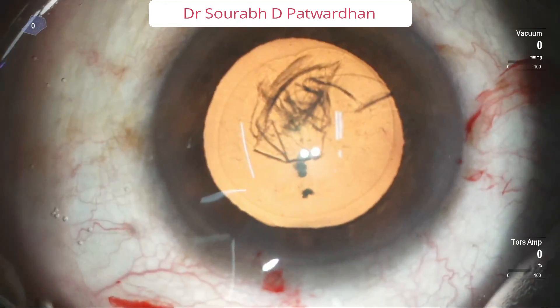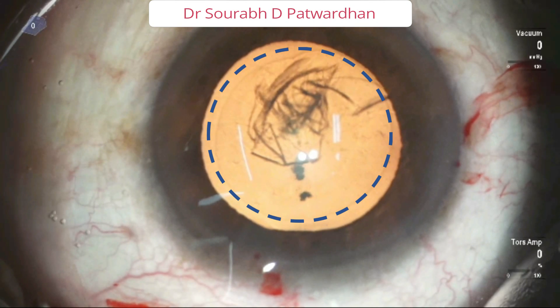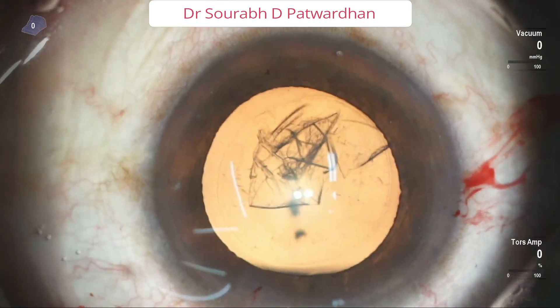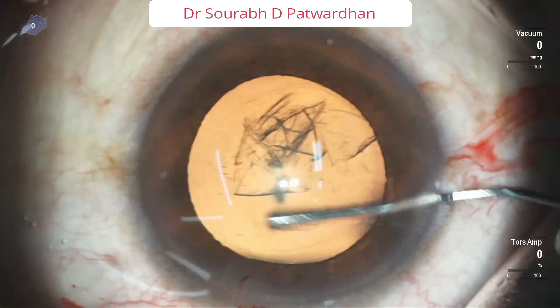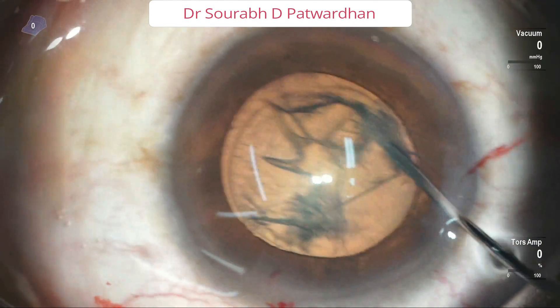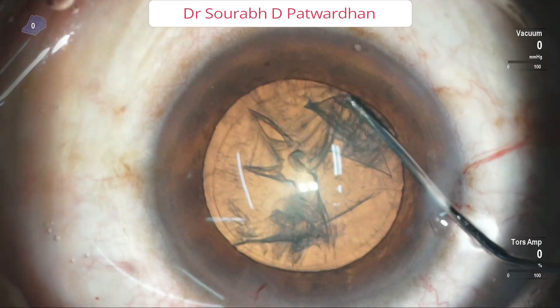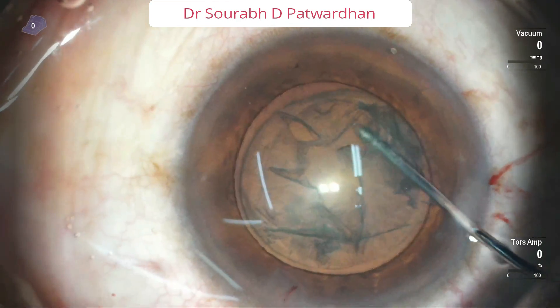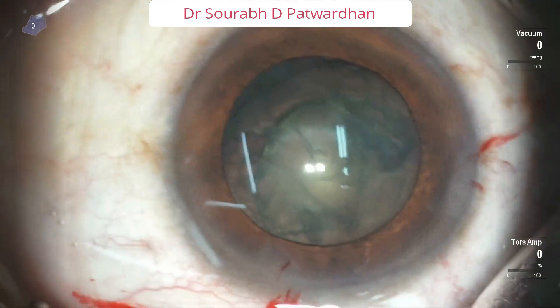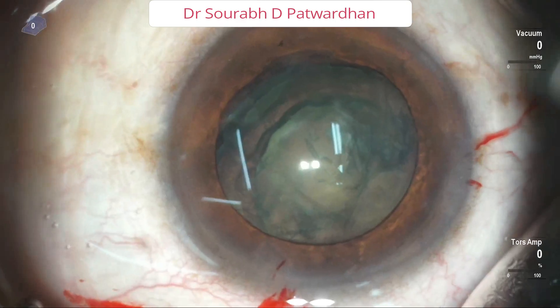This is the ideal CCC. Once you get the CCC right, the next important technique is to do a good hydrodissection. It is important to do a cortex cleaving hydrodissection like this. The fluid wave should be nicely visible. I push the fluid on both sides, and after that I have done hydro delineation by going into the substance of the nucleus.